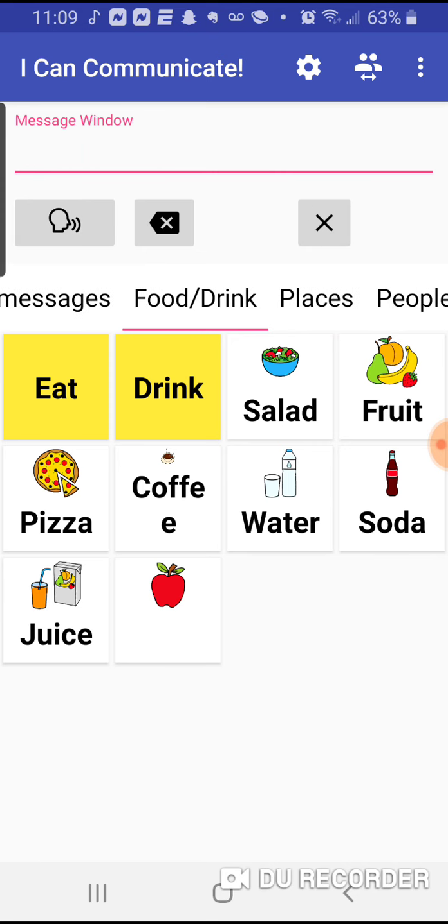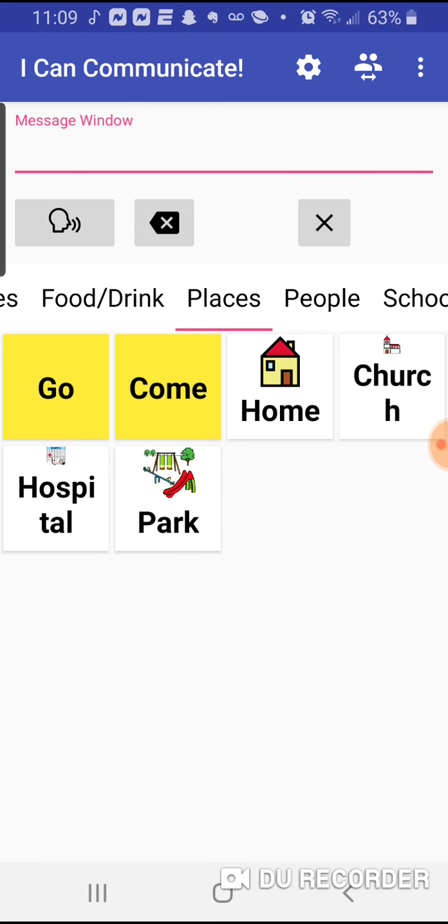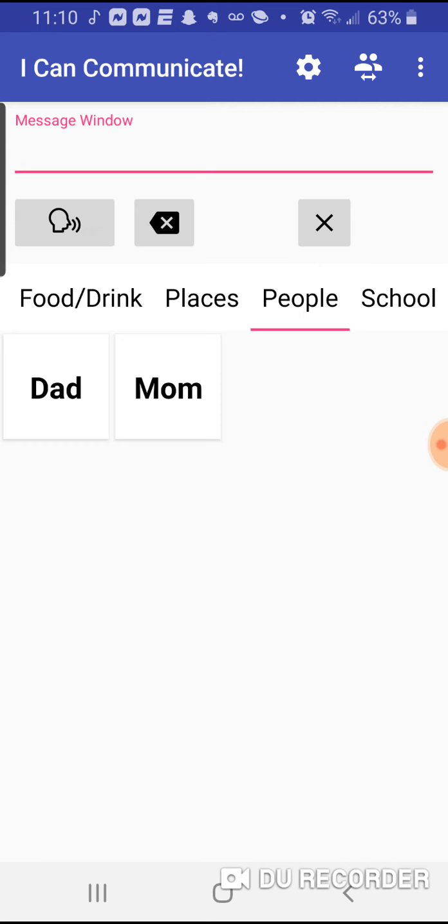And it can be done in any of these categories. Mom, dad, if they have a brother or sister or teacher, you can add them under people that they know. But I added school personally, just trying to figure it out a little bit before I started this video.